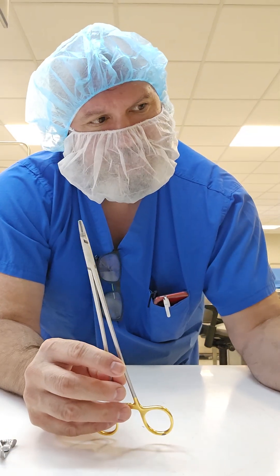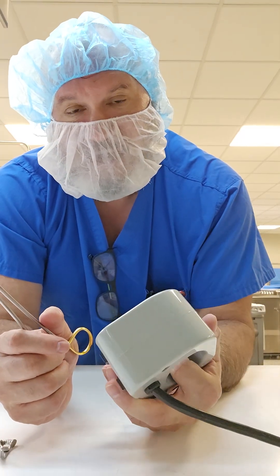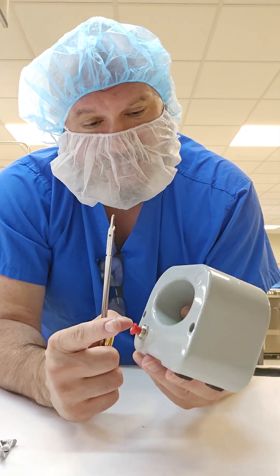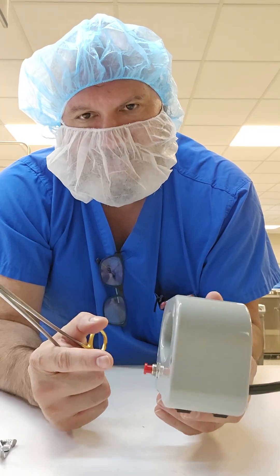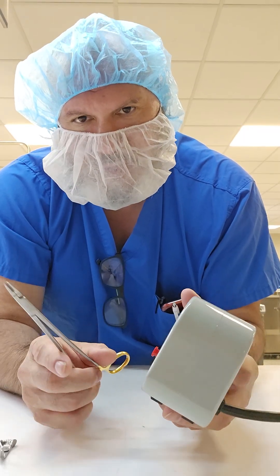And how would you do that? This is one of the many different tools available to demagnetize your instruments. Now, you have to watch the use on this because the longer you use it, it's going to heat up and overheat, and then you have to wait for a cool down period. But if used briefly and shortly, it will do the trick.